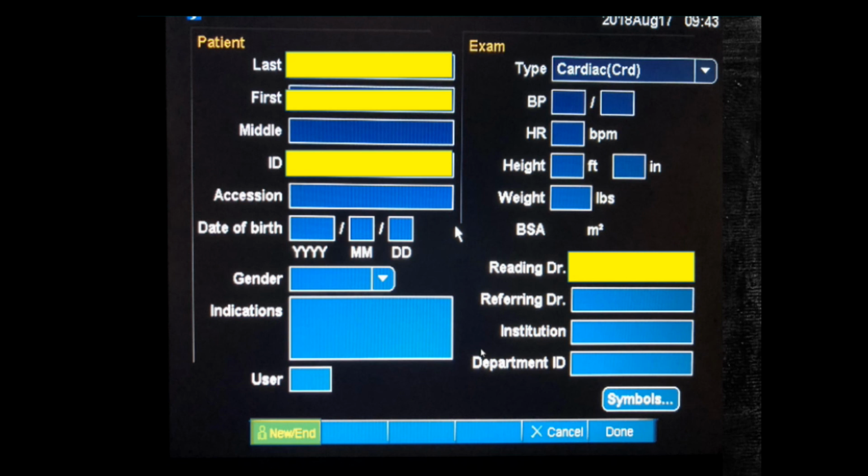All right, so we've optimized our image. We've started an encounter, we optimized our image, and we saved some images for uploading into the archive. Now we need to end the exam. And so you hit the end exam button, and for most systems, that is the key that'll start uploading into the archive.